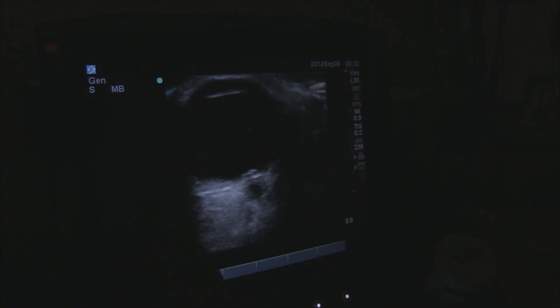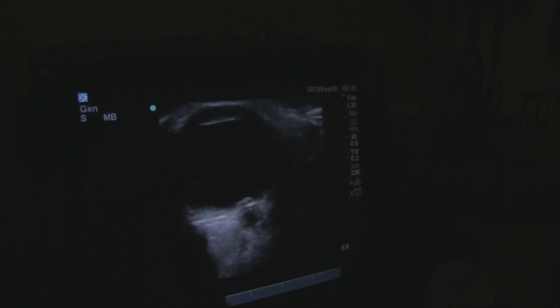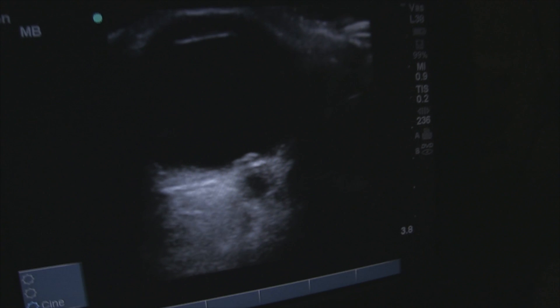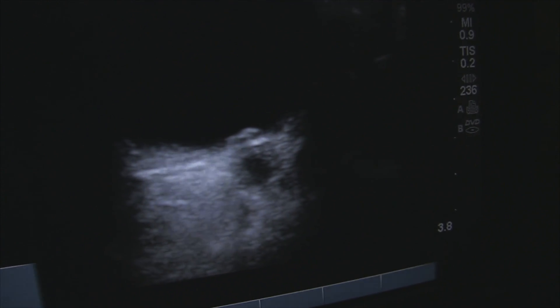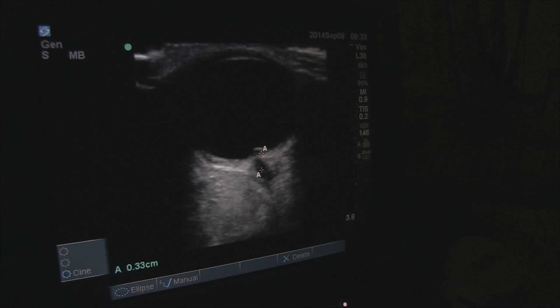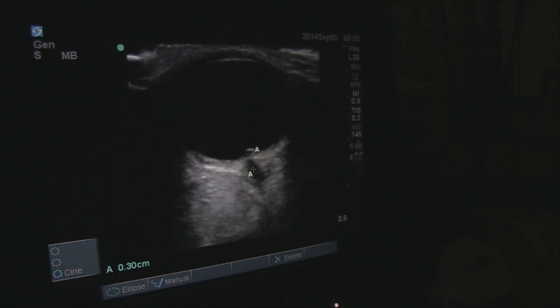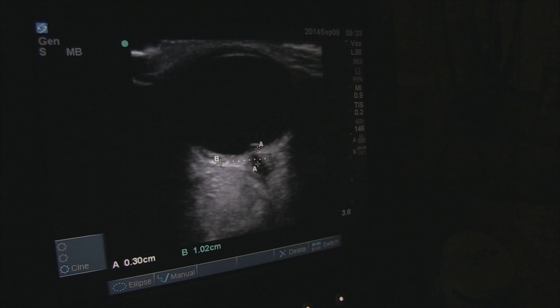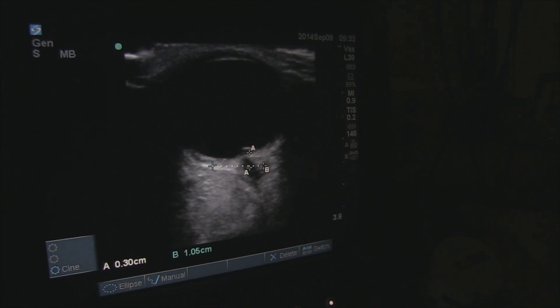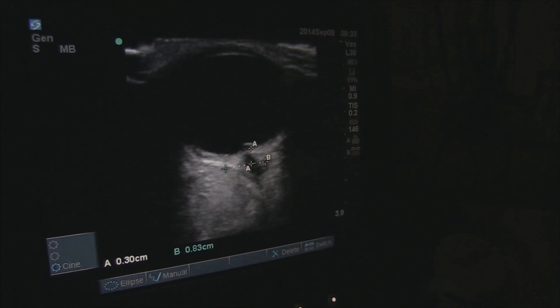So what we have here is the vitreous chamber right here, and the lens and iris is up here. Down here you can see where the optic disc is actually bulging up into the vitreous chamber, consistent with papilledema. And the retina is three millimeters back. So you start right at the retina, and then go three millimeters back — that's when you're doing your transverse measurement.